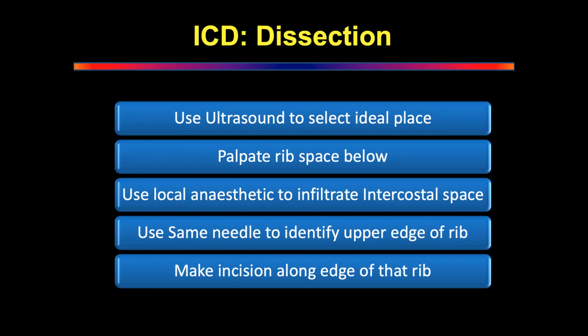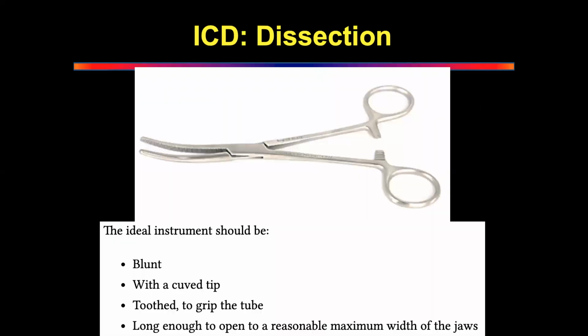Absolutely right. The left hand is the guard. The left hand is a guard against the skin. So you hold the instrument with your left hand to make sure you don't suddenly give way. Is this clear? So the right hand is dissecting, the left hand is the guard. It will guard against suddenly pushing into the pleural space. Does that make sense, what I just said? Yes, sir. Okay, thank you very much.